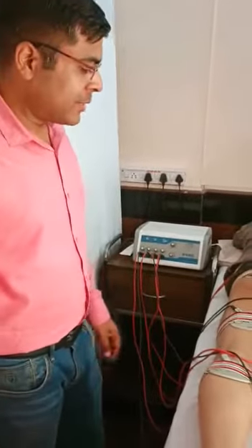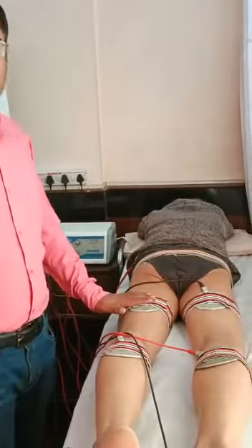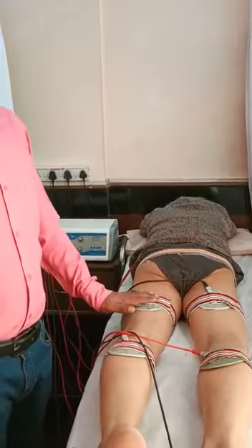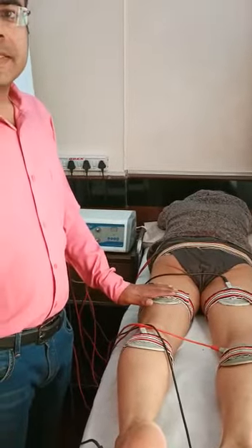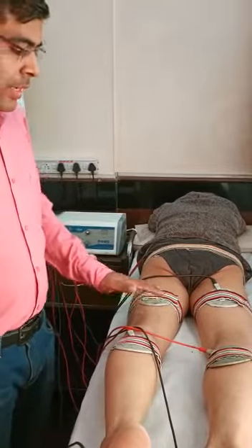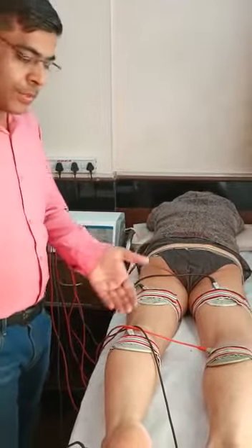What it does — it helps in pain due to sciatica, carpal tunnel syndrome, diabetic neuropathy, any kind of radiating nerve pain, tingling, paresthesia, numbness. What we have done is we have applied pad electrodes in the leg.